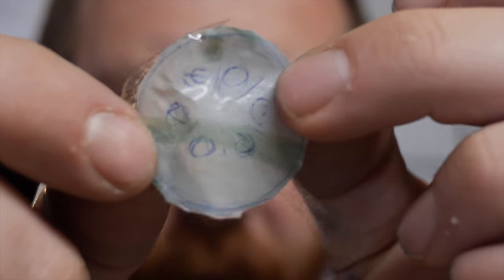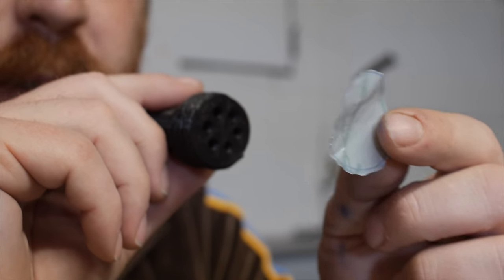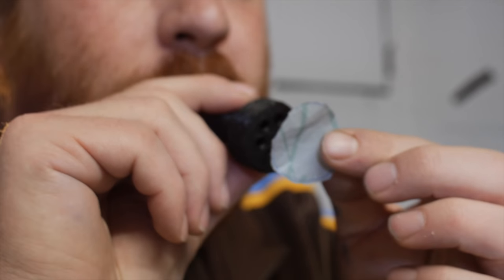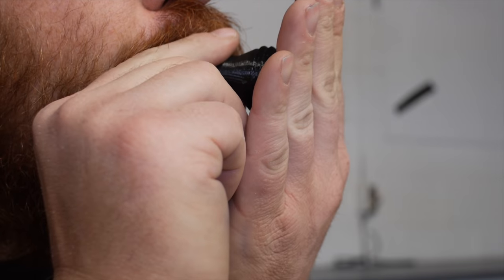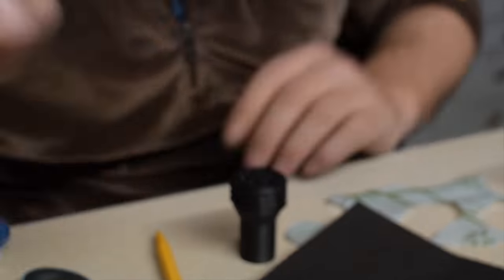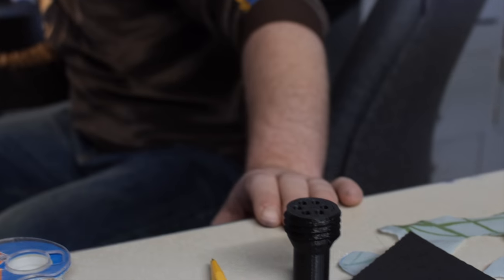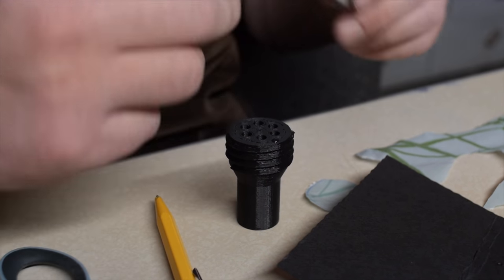It never sealed perfectly. But I did notice this property of the valve: this is just a Walmart bag, a regular, thin membrane. You'd probably use a Ziploc bag or something more food safe. But watch this. What we're thinking about doing is, let's just do it. I'm just going to use a dot of cyanoacrylate. I'm not sure that's the medically appropriate thing, but for the prototype, I think it's fine.